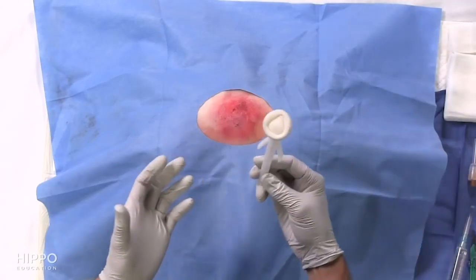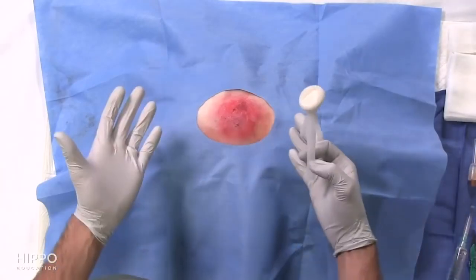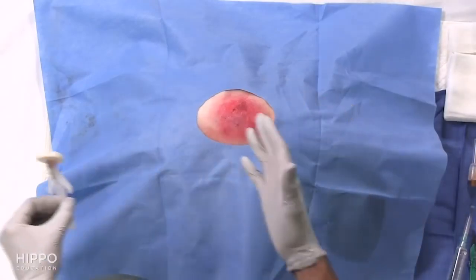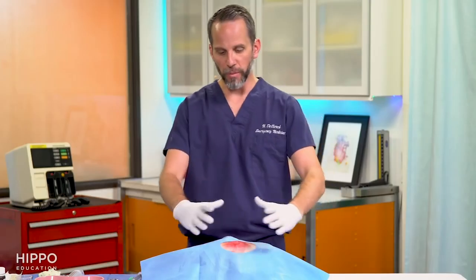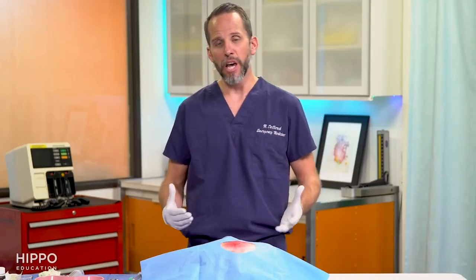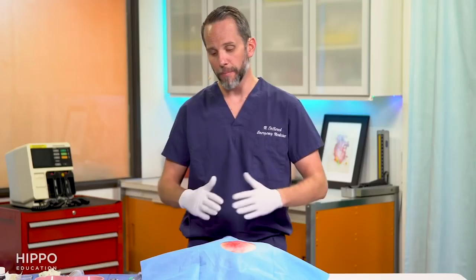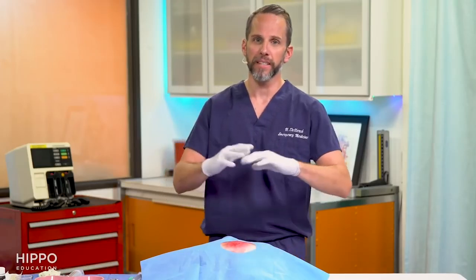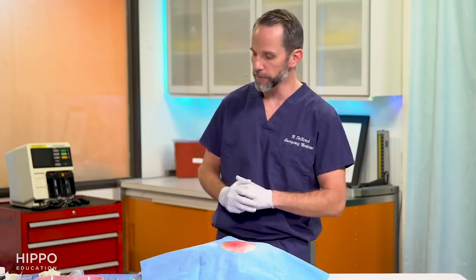The first step is cleaning and prepping the patient. Usually I use chloroprep or betadine and then drape it. Make sure you have enough space to really access the abscess, and be aware that purulent material might go in other directions, so protecting the patient from that is helpful. The nurses are also very happy when you protect the bed sheets from all the pus that can come out.